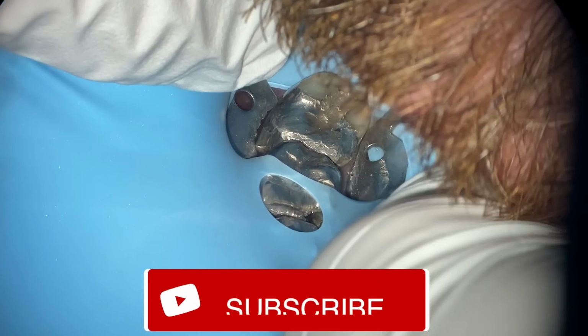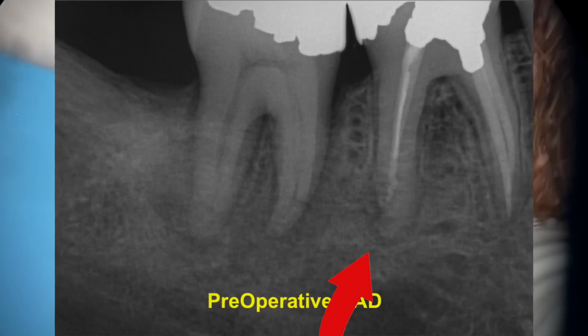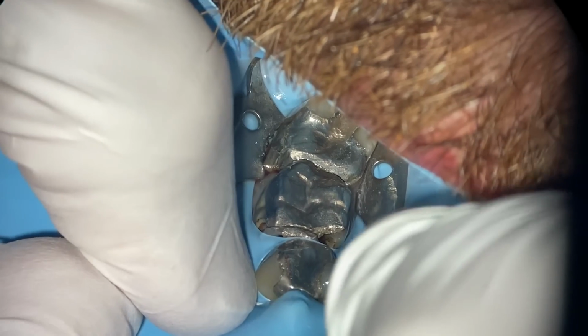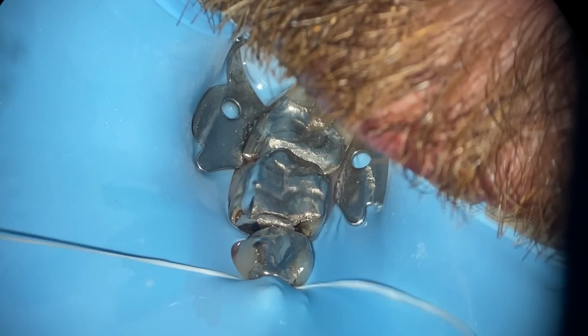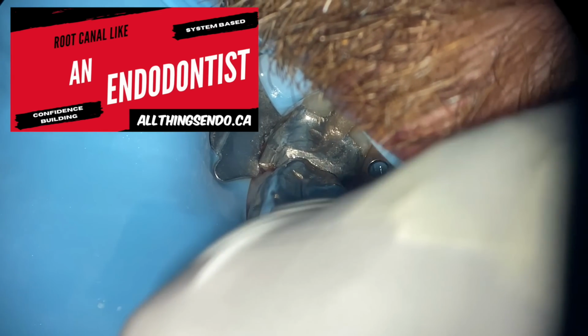As well, this is the short version of a retreatment on tooth number 4.6 and the complete calcium hydroxide case on tooth number 4.7. But while I was editing the video of the retreatment, there was that mesial buccal canal that was just hidden. And I was like, you know what? There was a question in our course at allthingsendo.ca that was asking, how do you find those buccal canals?